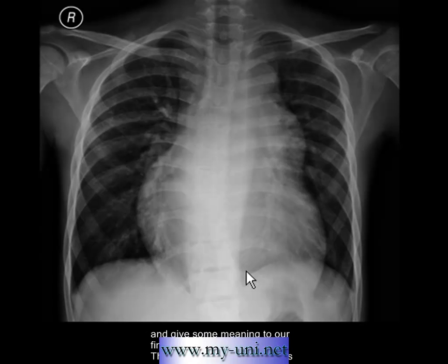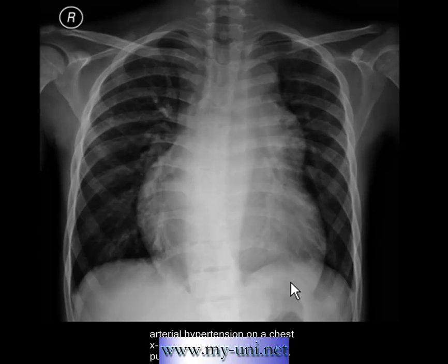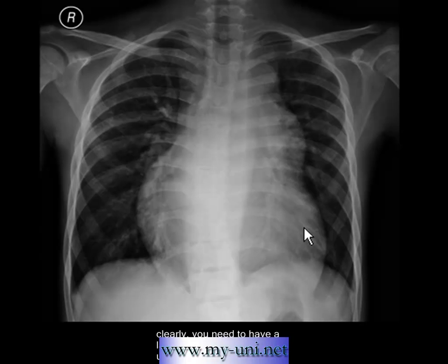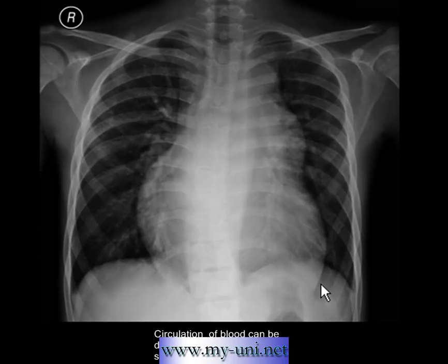This X-ray shows all the features of pulmonary arterial hypertension. There are only two radiological features needed to diagnose PAH on a chest X-ray: first, dilated central pulmonary arteries that quickly taper as they go into the lung parenchyma; and second, right ventricular hypertrophy, which can also enlarge the right atrium. Right ventricular hypertrophy is best seen on a lateral view as enlargement of the anterior superior cardiac margin.